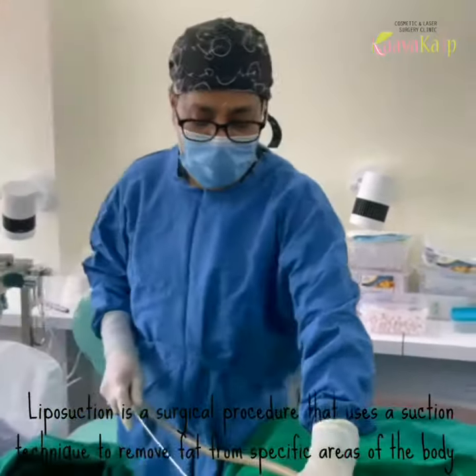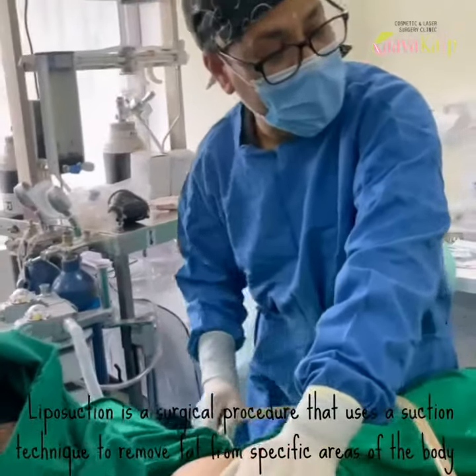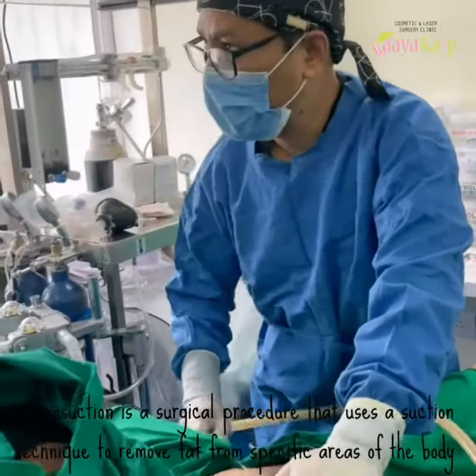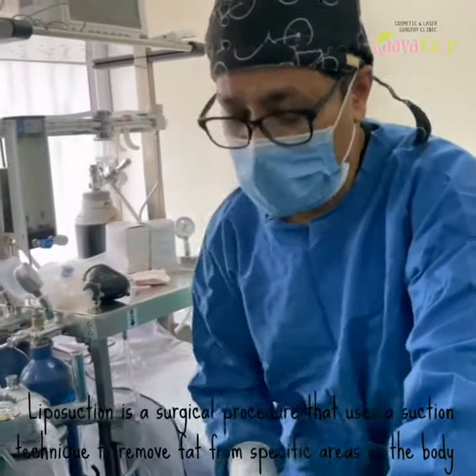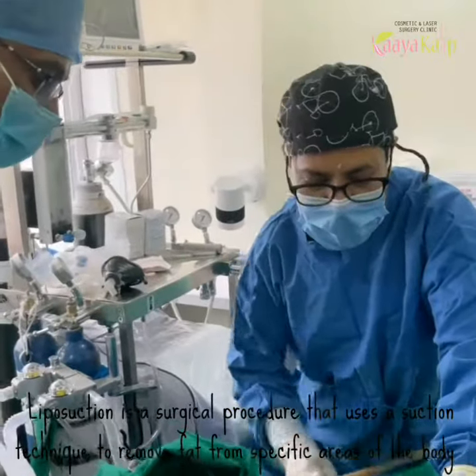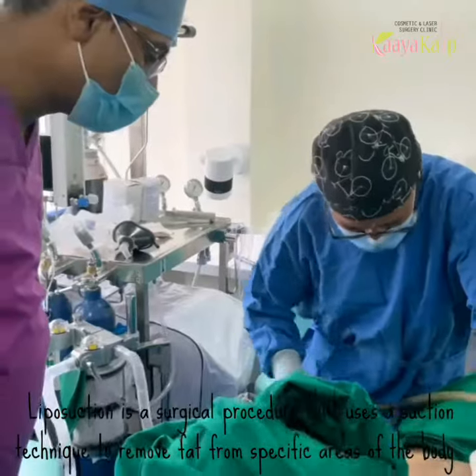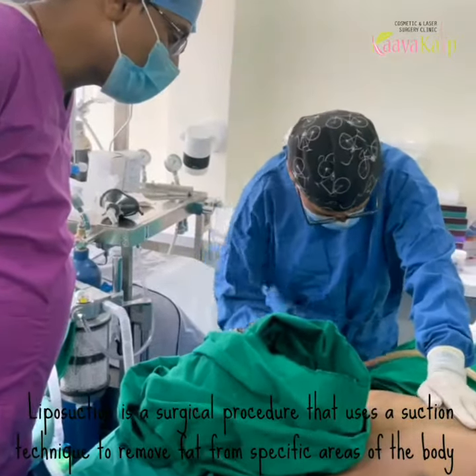So let us start liposuction on the left-hand side. Please switch on the machine. My palms and fingers are going to guide my cannula. As I told you, at any place one should not do more than three strokes — keep changing like a wiper of a windscreen. You can see the fat is coming.